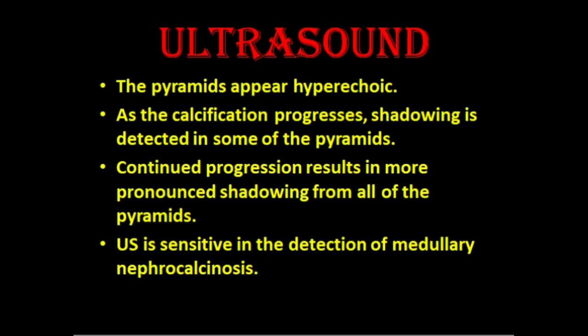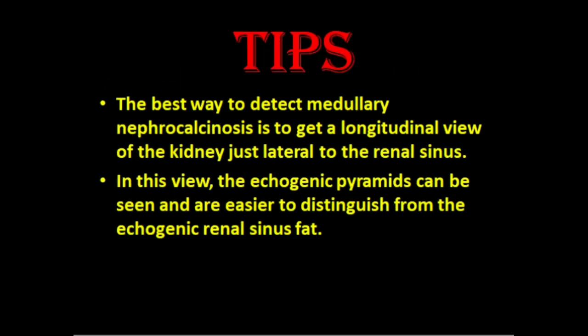Ultrasound is very sensitive in the detection of medullary nephrocalcinosis. The best way to detect it is to get a longitudinal view of the kidney just lateral to the renal sinus. In this view, the echogenic pyramids can be seen and are easier to distinguish from the echogenic renal sinus.